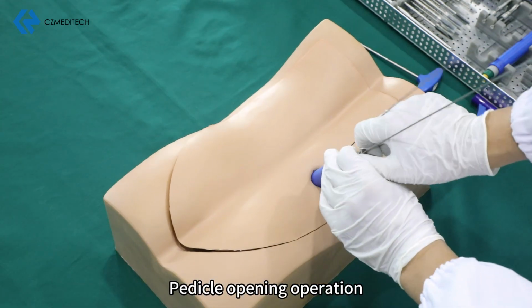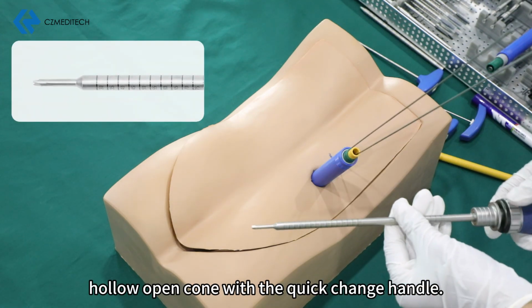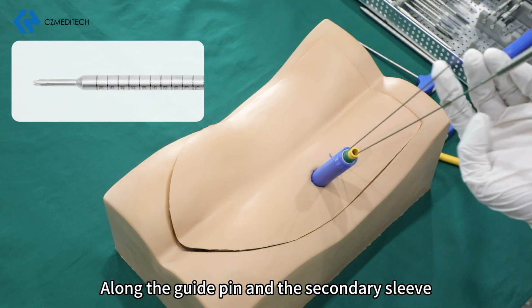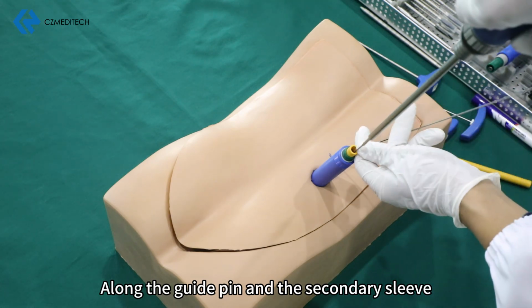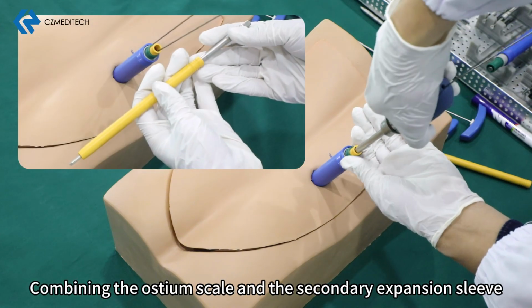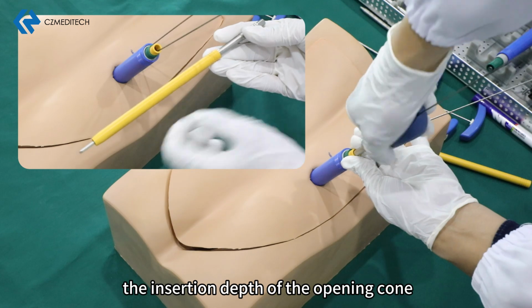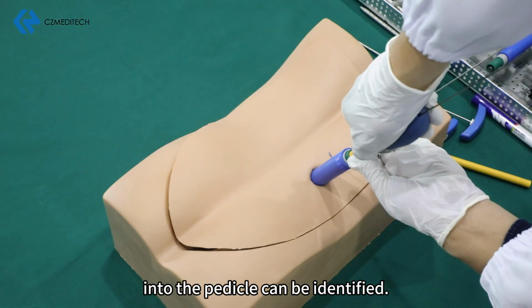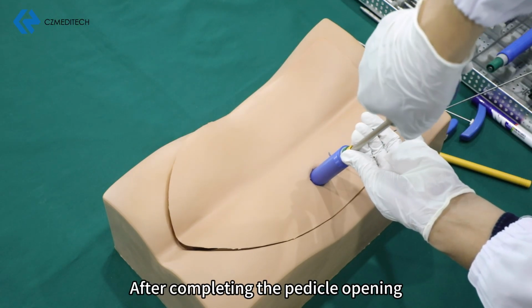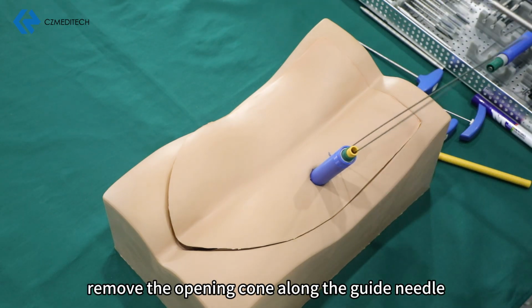Pedicle opening operation. Pull out the primary metal sleeve and match the hollow open cone with a quick change handle. Along the guide pin and the secondary sleeve, the pedicle was opened with an open cone. Combining the ostium scale and the secondary expansion sleeve, the insertion depth of the opening cone into the pedicle can be identified. After completing the pedicle opening, remove the opening cone along the guide needle.